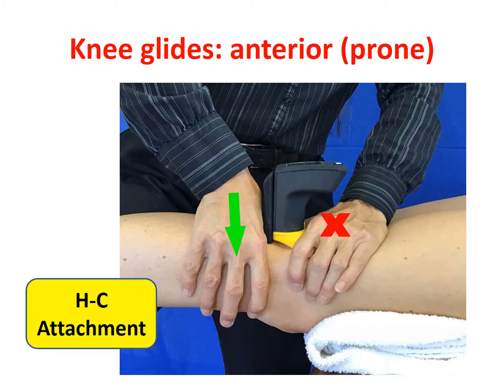Right? What's great about using the Mobil-Aider device is that if you wish to perform a technique and want to be precise about it, allow me to give you an example. If the person's anterior glide is 4 millimeters and you decide you want to do a grade 4 mobilization, then you want to be at the end range, in other words, at that 4 mm barrier, and you want to have small oscillations. So you would be looking to the device to give you feedback at that mobilization being at the 3 to 4 mm range. Right? Small oscillations at the end range would basically confirm that you're doing a grade 4 mobilization.